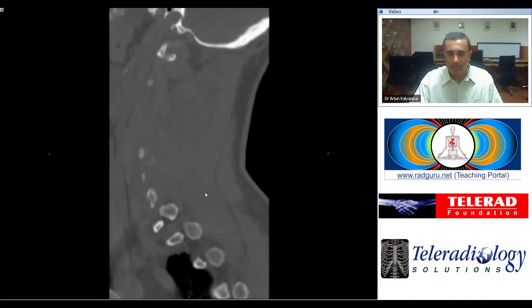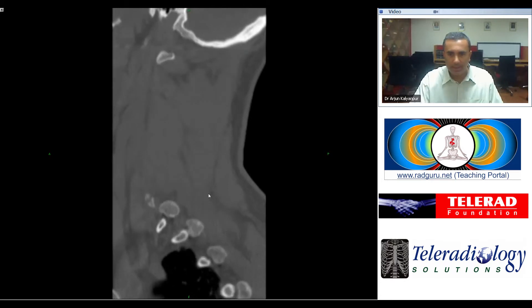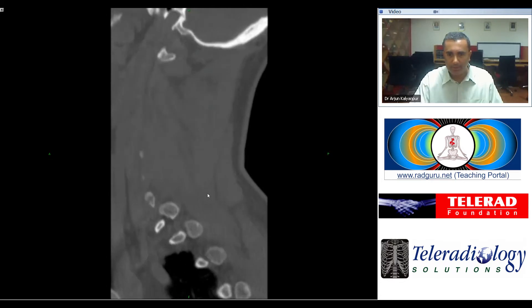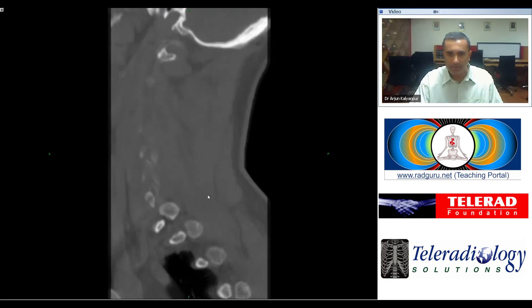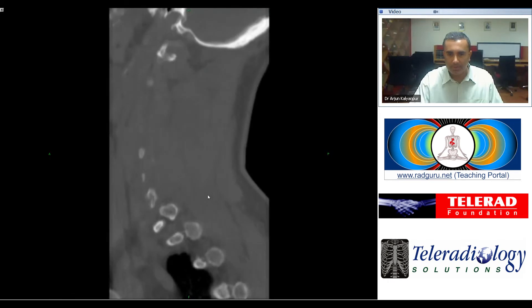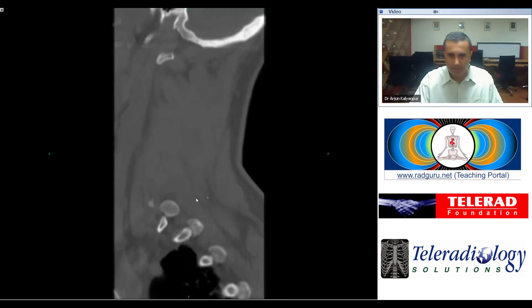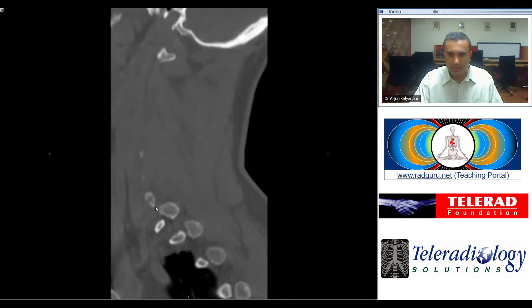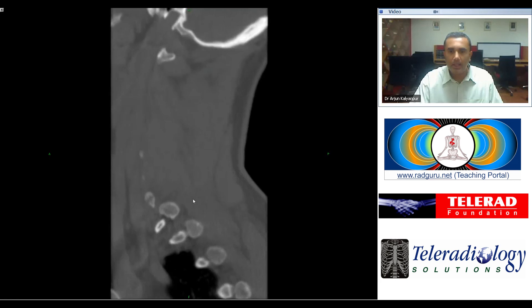So the teaching point in this case is that it's important to look at all the reformats in sequence on a cervical spine CT, or for that matter in any multi-detector CT examination, because some findings which are not apparent on routine axial imaging may spring to our attention when we look at the orthogonal plane reformats — in this case, the sagittal reformats for this extremely subtle transverse process fracture.